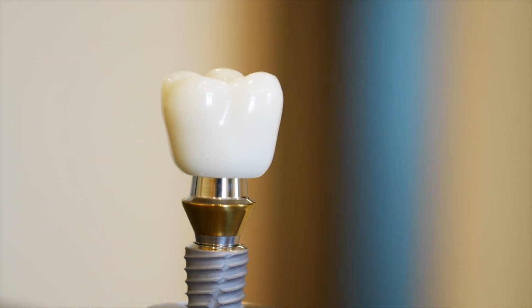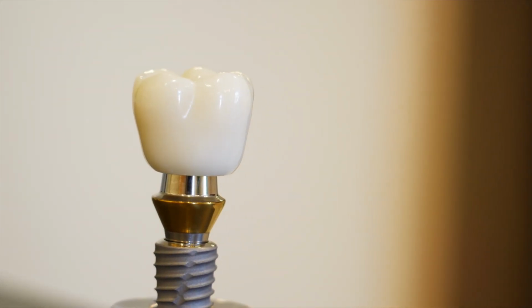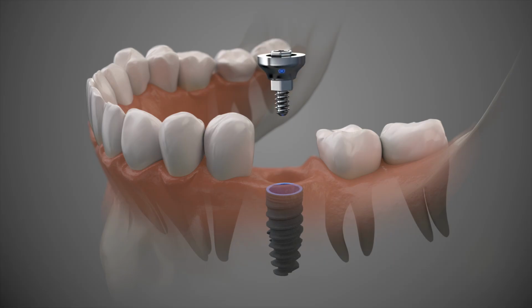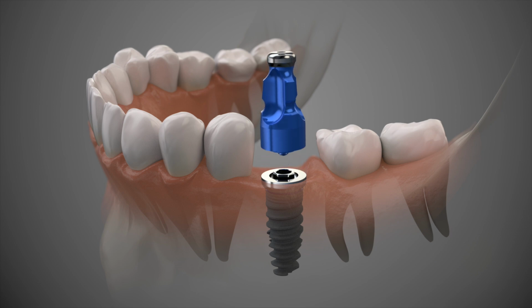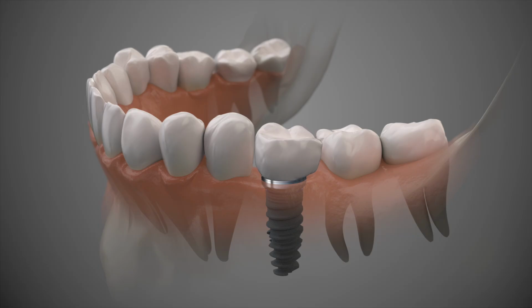We see variations like the V-thread, common and efficient for self-tapping, and the square thread, with greater surface area and theoretically better load distribution, but harder insertion. Aggressive, deep threads are designed for self-tapping and faster insertion, but risk overheating dense bone, D1. Compression threads are wider and designed to engage the cortical bone, improving stability but requiring extremely careful drilling. The macro design is the surgeon's tool to overcome challenging bone architecture revealed in our CBCT planning.